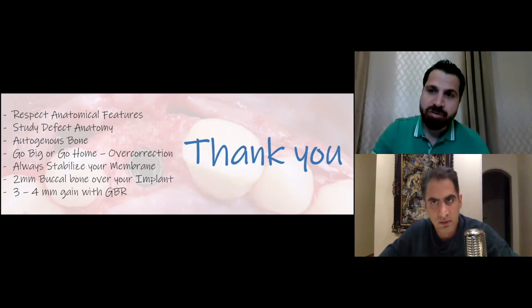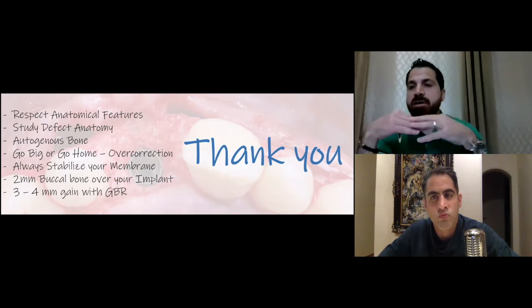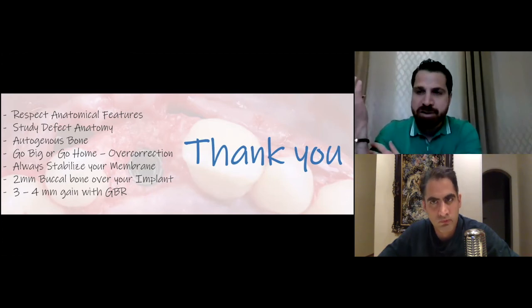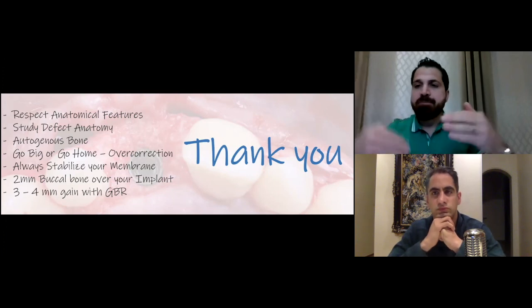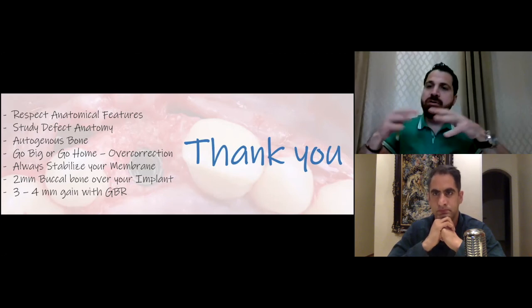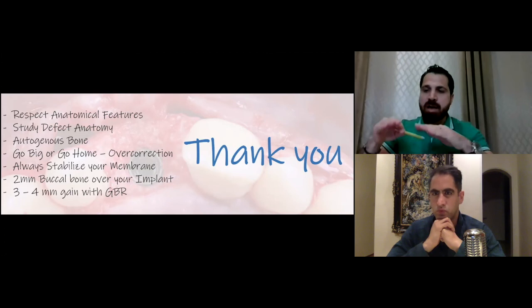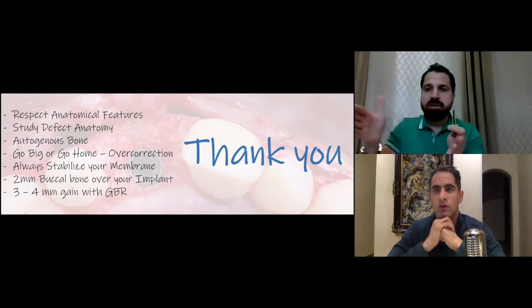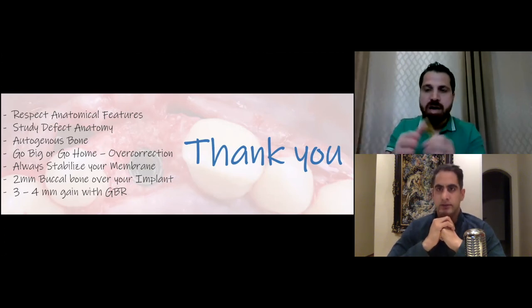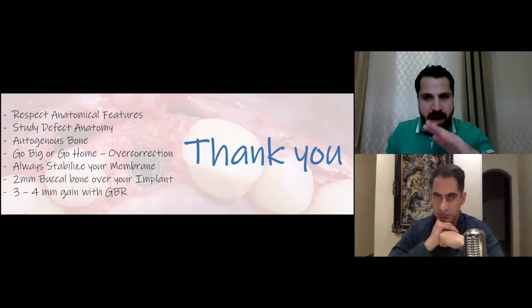Yeah, actually, this is what we did. When you're doing your overcorrection, you're really packing bone, and you're making a bulk of bone. I don't only put it on the lateral position. I just pack it all over. Yeah, good. This is what I do. I pack it over.